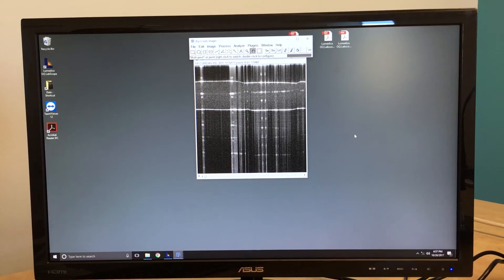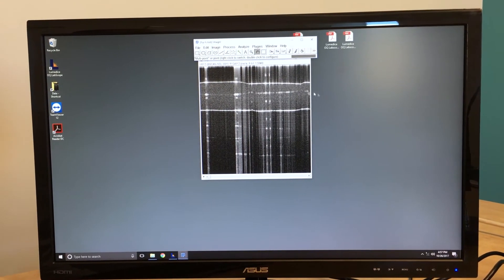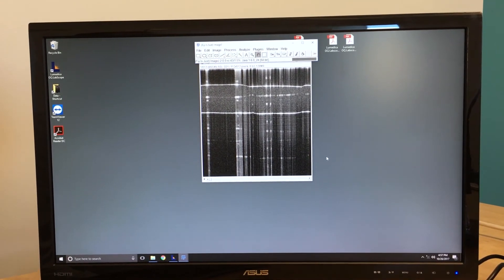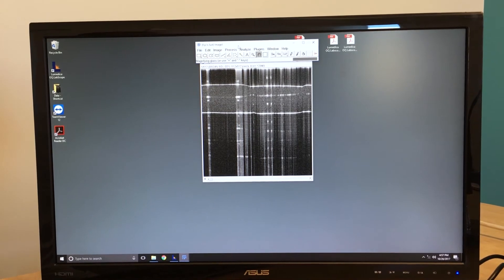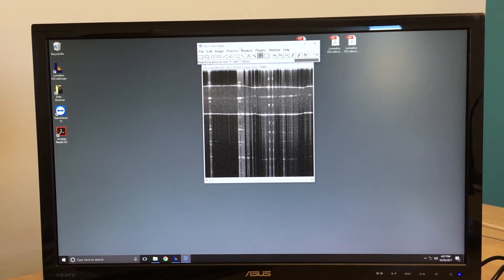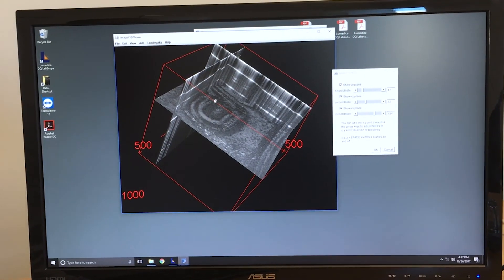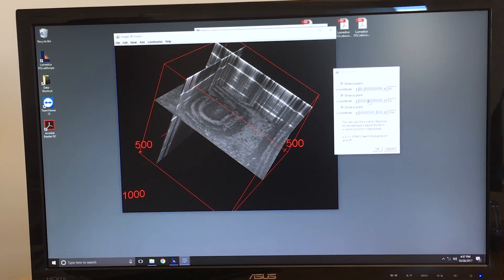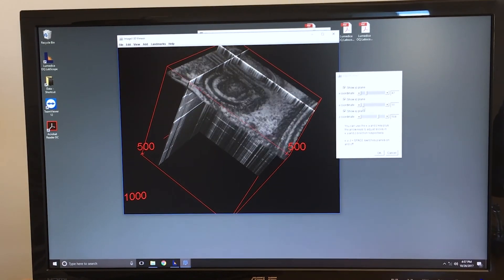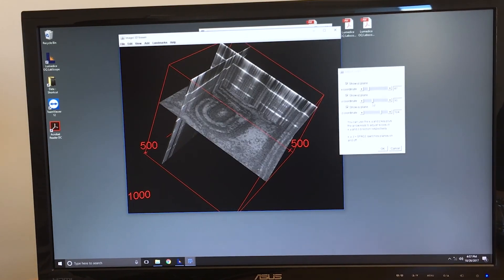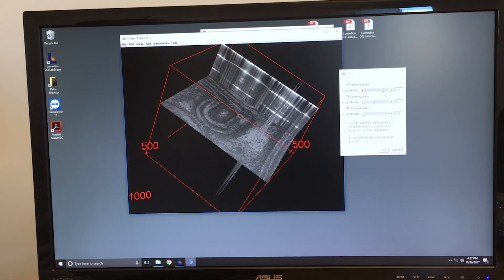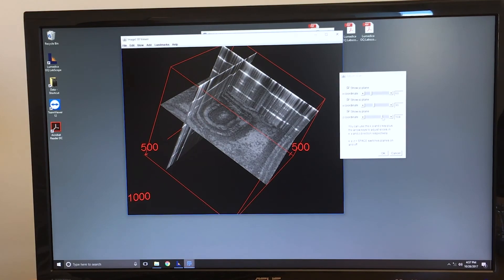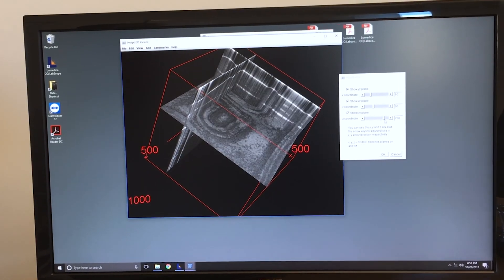To view your 3D volumetric image, simply open the image stack using a 3D viewer, such as the free ImageJ plugin available from NIH. After loading the data into the 3D viewer, it's easy to process all the various layers. And here we can nicely see the writing on our cup, and you can see data in X, Y, and Z.